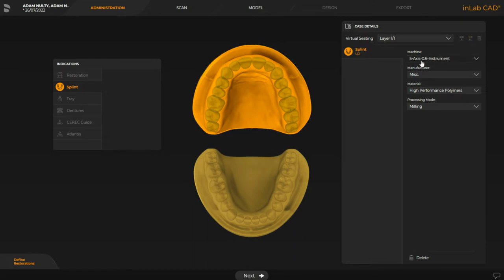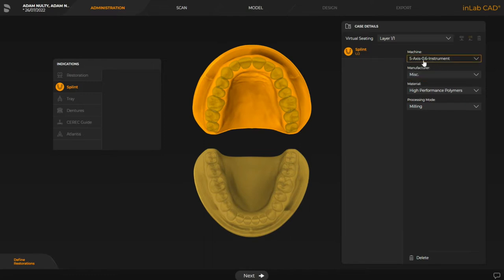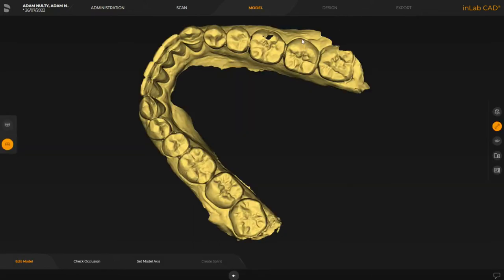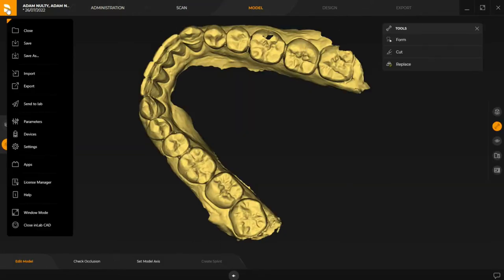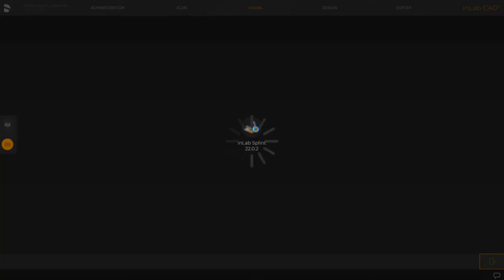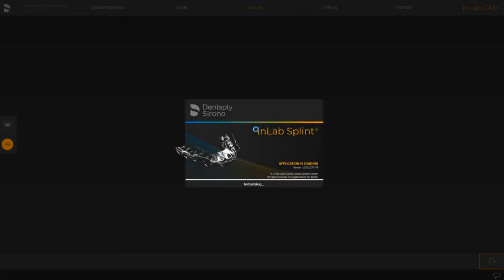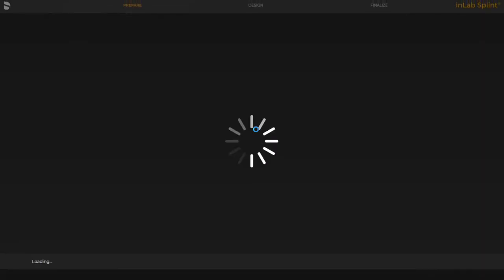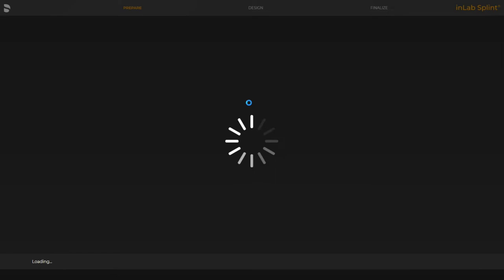Just remember that we're going to be choosing the 5-axis instrument, or if you're going to be milling out in your MCX5 then that's an option, but we're going to choose the 5-axis instrument if we're going to be 3D printing, and just choose high-performance polymers — it's saying milling because we don't have the 3D printing option there yet. So we've brought in the scans, we've got to the model stage, and the next stage is we're going to click on the Dentsply logo, click on apps, and click on in-lab splint. That will load up the in-lab splint app and set everything up for us to work through the workflow according to whichever arch we've set for the splint design.